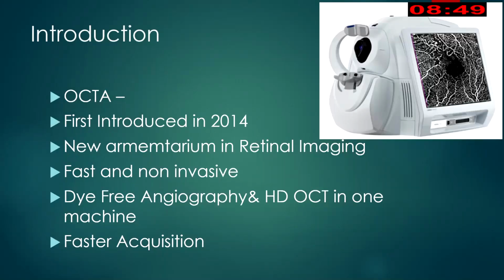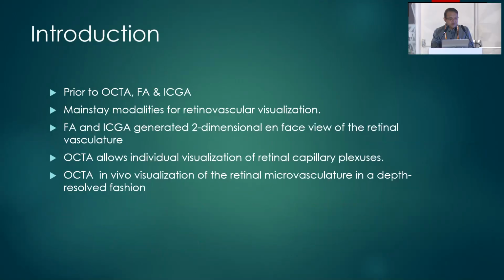Thank you, Ritesh. We'll start our IC, and basically first we'll learn what is OCT angiography and how to interpret it. OCTA was first introduced in 2014. It is a new armamentarium in retinal imaging, fast and non-invasive, dye-free angiography with high-definition OCT in one machine.